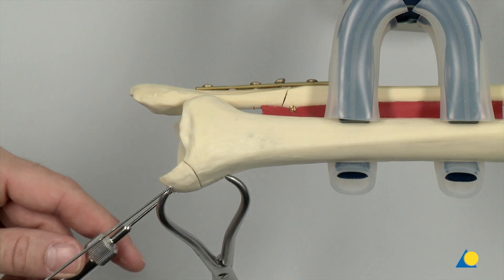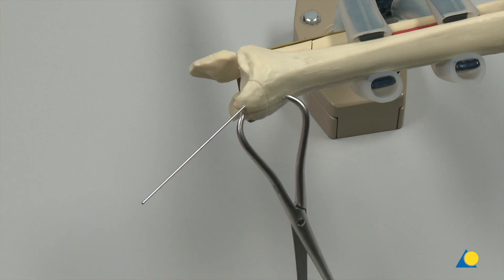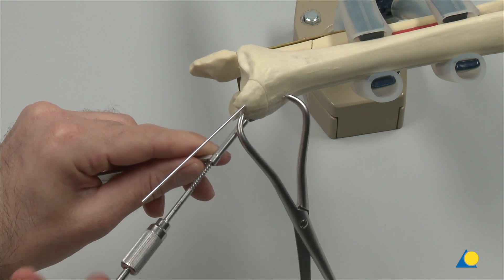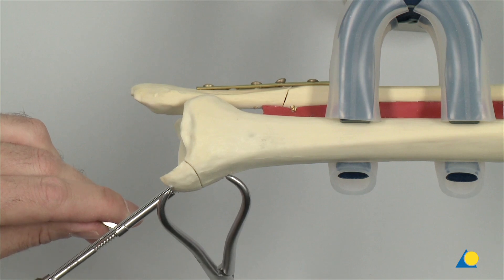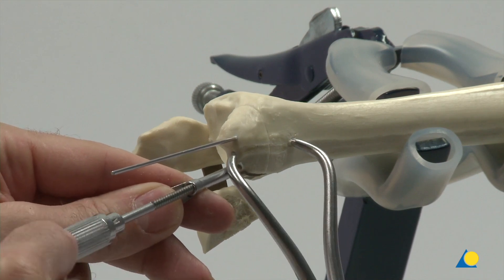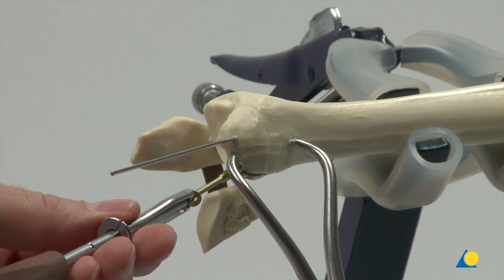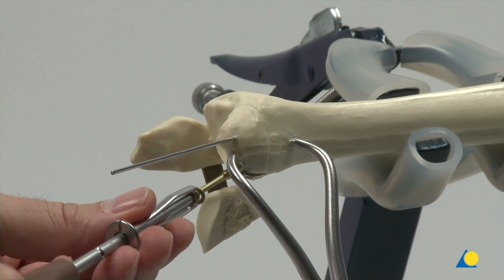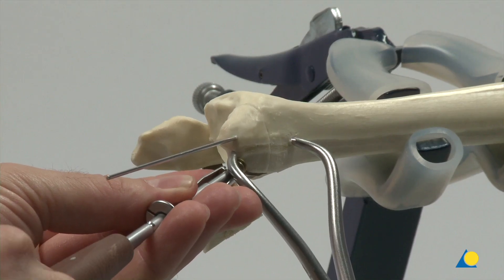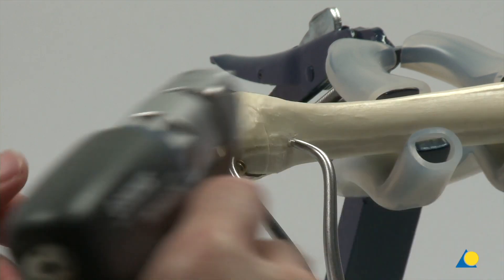The required length of the screw is measured with the depth gauge. The 4.0 mm cancellous tap with appropriate sleeve is used to create the threads. The 4.0 mm partially threaded cancellous screw is inserted with a washer to achieve interfragmentary compression. The K wire is removed.